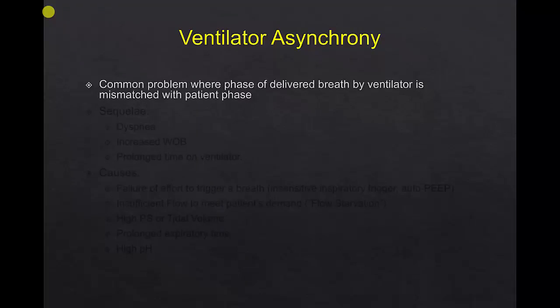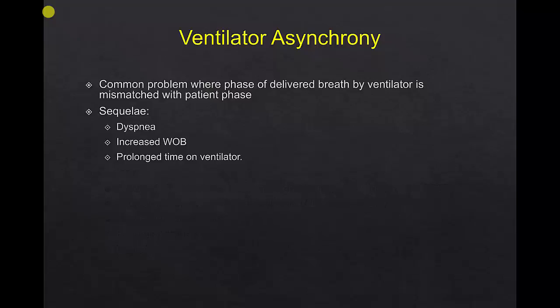So let's start with ventilator asynchrony. Ventilator asynchrony is a common problem where the phase of the delivered breath by the ventilator is mismatched with the patient's respiratory effort. Sequelae of ventilator asynchrony include dyspnea, increased work of breathing, and prolonged time on mechanical ventilation.